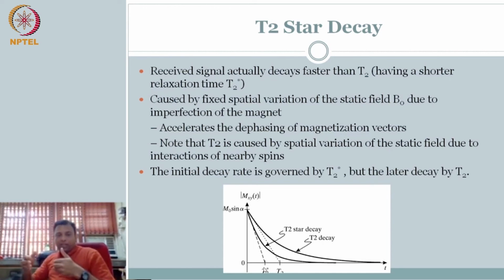So perhaps if you want to play this game multiple times, it will be prudent that T2 is much greater than T2 star, and therefore you may have some cushion in getting the signal, allowing it to decay, measuring it again. Easiest way is I allow everything to come to equilibrium, push it to the floor, measure T2. Right? Initially it will be T2 star.